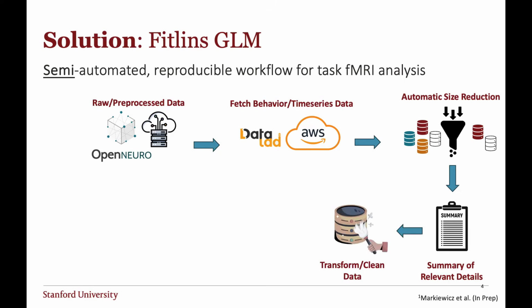And then the next steps are effectively cleaning, preparing, and transforming your data. I'm not sure how many of you work with OpenNeuro data, but the events files that are uploaded are sometimes a headache, or put lightly, a mess. So there's oftentimes a lot of cleaning needed when you're going through the workflow in order to get the data ready to then fit your models. And oftentimes this means going through papers and reading the methods sections, because often the details aren't readily available. And so you need to do it in a quick and effective manner.